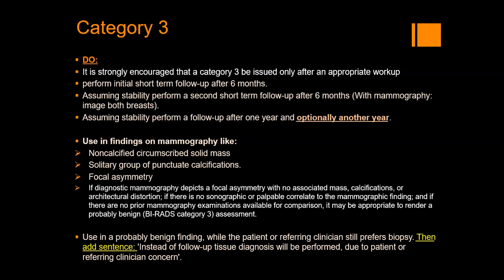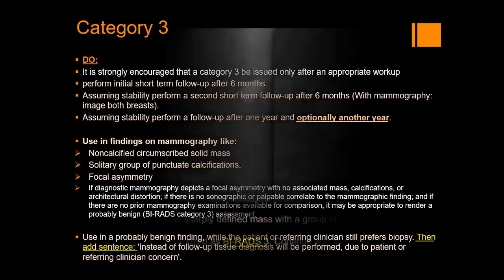Use in probably benign findings while the patients or referring clinicians still prefer biopsy. If they prefer biopsy, we should not shift to BIRADS 4. Still, we report it as BIRADS 3. Then we will add the sentence: instead of follow-up, tissue diagnosis will be performed due to patient or referring clinician concern, or their willingness.